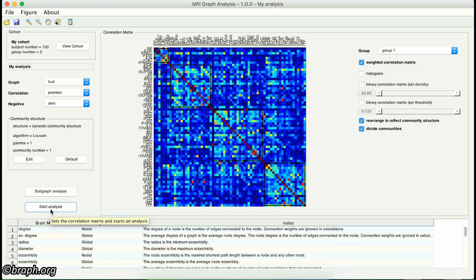Welcome back to the tutorials of BRAF. In the previous videos, we have seen how we can create and modify brain atlas and an MRI cohort using BRAF. In the first part of the tutorial of the MRI graph analysis package, we have gotten familiar with the initialization of the graph analysis.